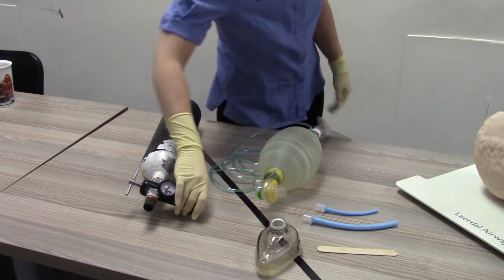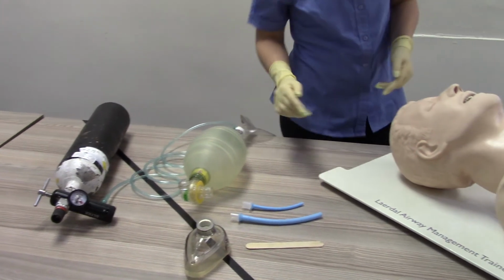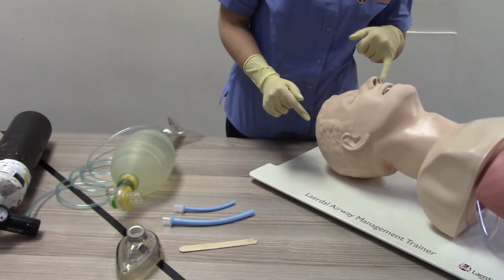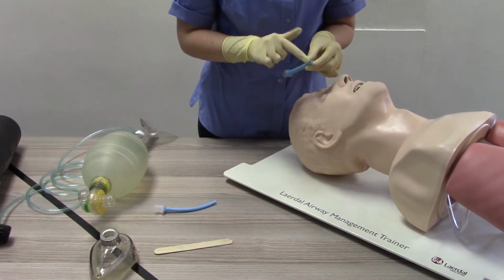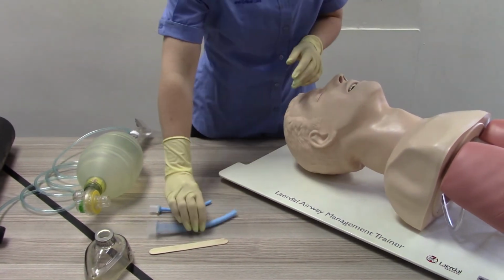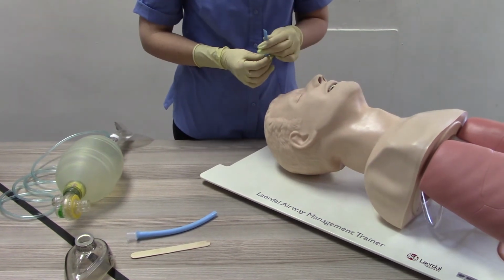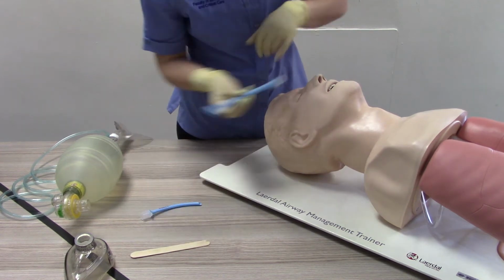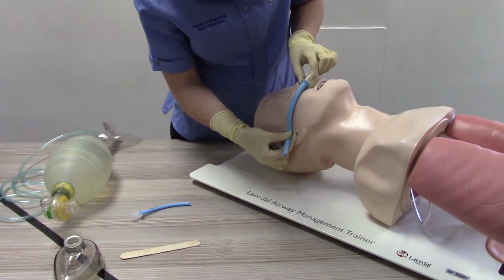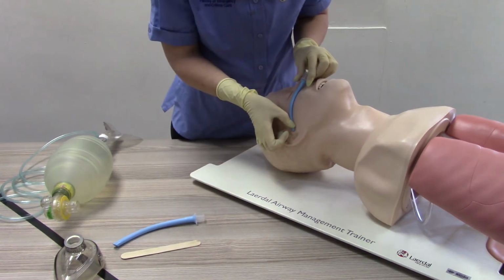Select the correct size nasopharyngeal tube by comparing the outer circumference of the nasopharyngeal tube with the inner aperture of the nares, or measuring the external nare to the tragus of the ear. Lubricate with water-soluble lubricant.